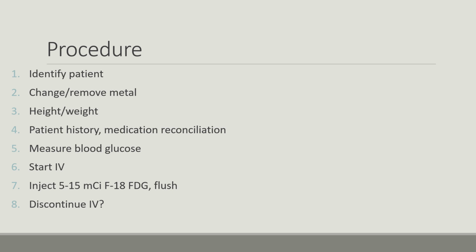And then there's always a question whether or not to discontinue the IV. It may be a good idea to leave it in case the patient has any issues before you get them on the camera. Otherwise, you may remove it. That depends a little bit on your department protocol.